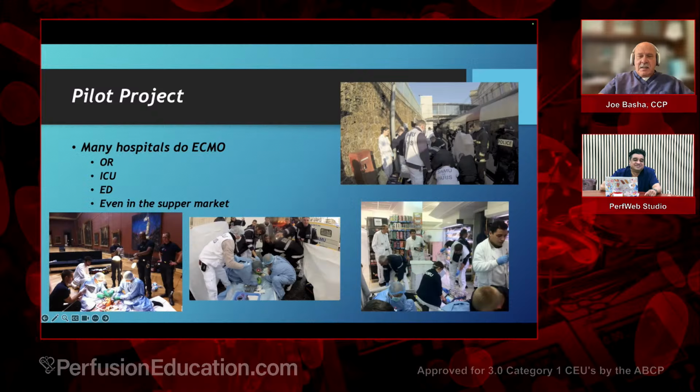And this is real. It's like a mobile ECMO unit, right? I think that they have like over there. Yeah, correct. Mobile ECMO unit. They have an ambulance, and they go everywhere, and they put these patients on ECMO. It's really pretty impressive.